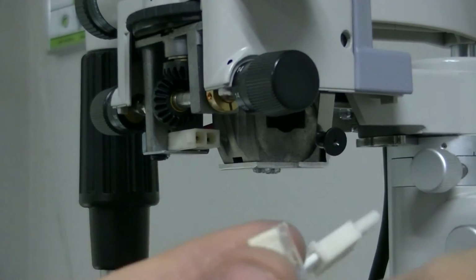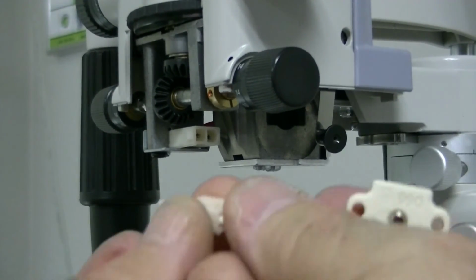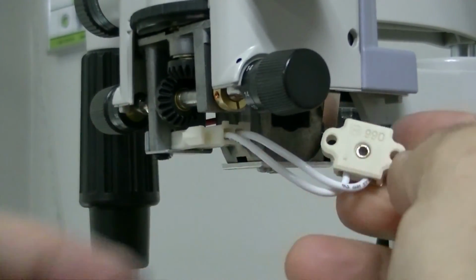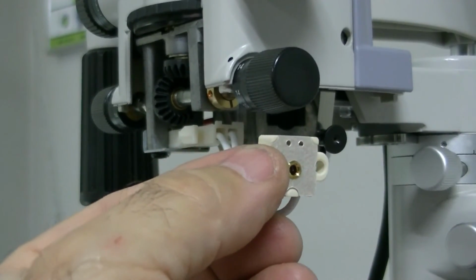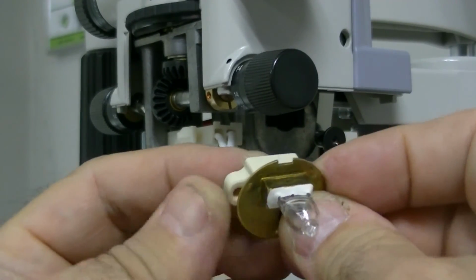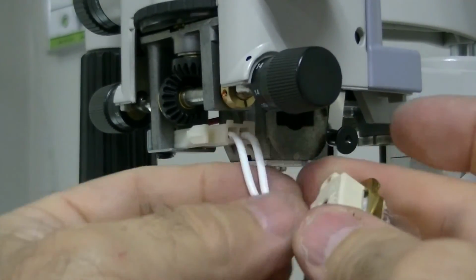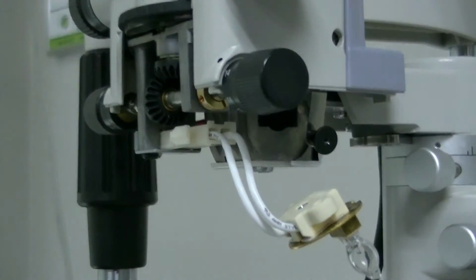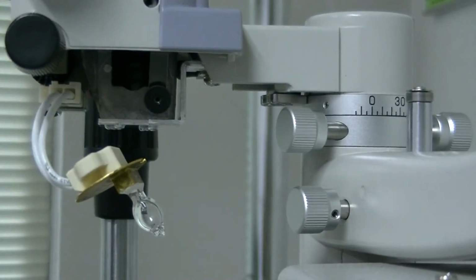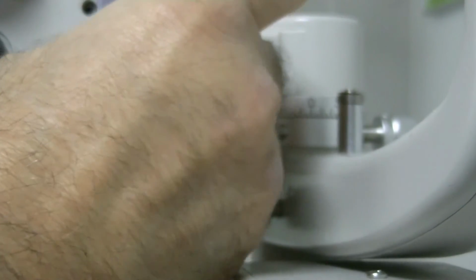To put a new bulb socket in, get your new bulb socket from your accessory box. This clip, push it right back into these two prongs here till it snaps in place. Then take your new bulb, put it in the two holes like this. Take your keyway, align your keyway up so that it is in underneath in that little notch up on the top. So put the bulb back in the block so it's in the keyway, pull out your tab and lock it in place.